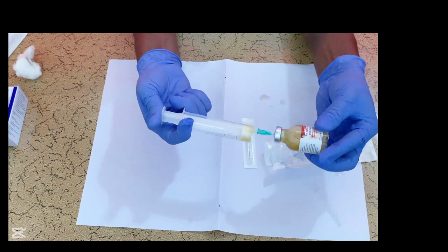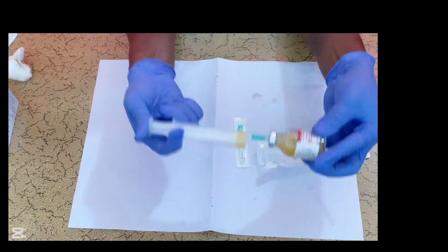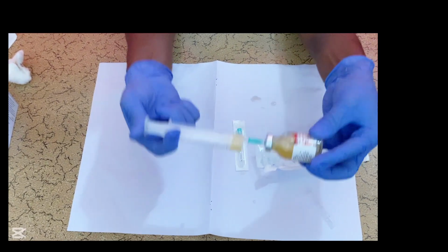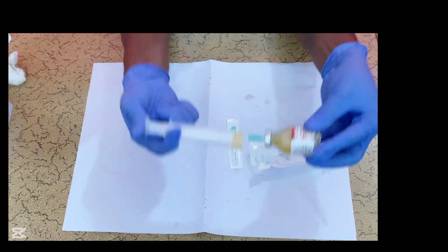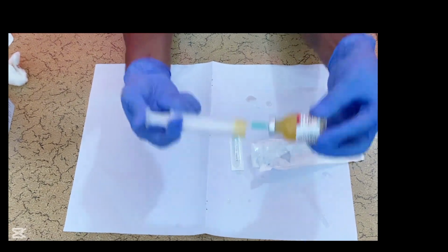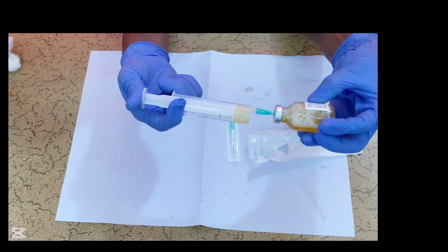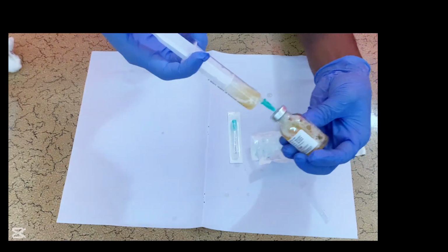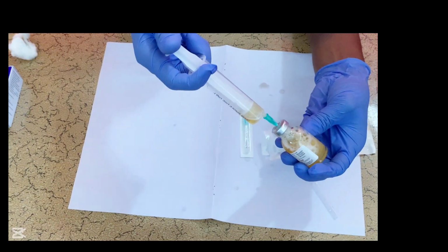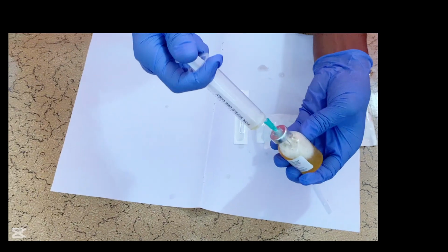Then make sure you check the vial gently like this until all the drug is completely dissolved. I hope you can see. Then you push the plunger gently, making sure you put it all in.